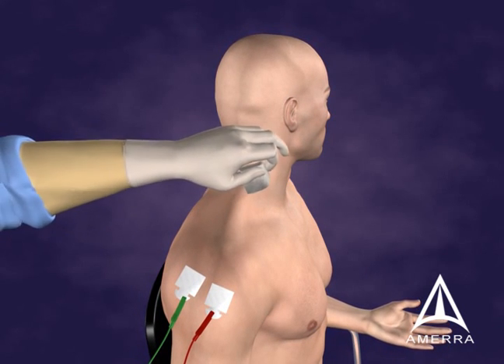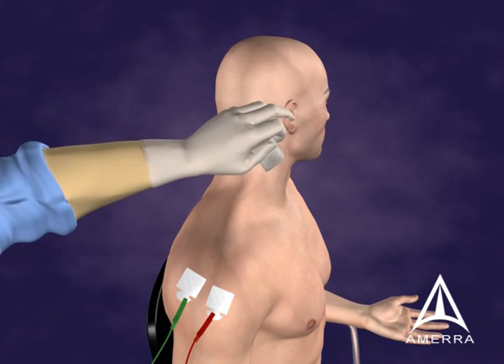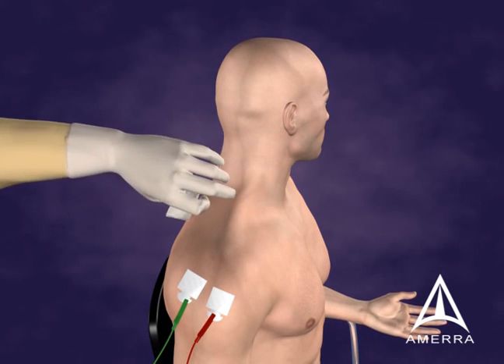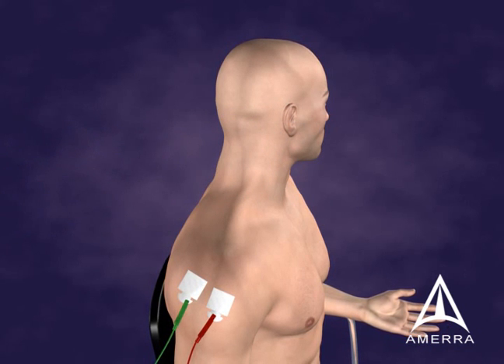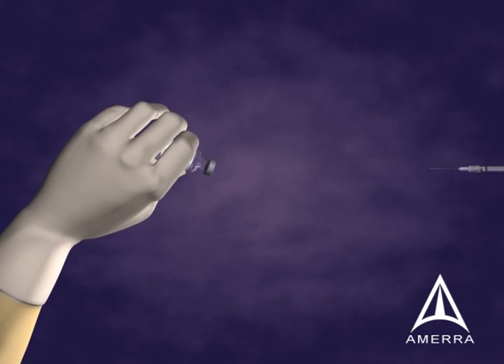The area to be injected is cleansed with alcohol, and the botulinum toxin is withdrawn into the syringe to be utilized for treatment.